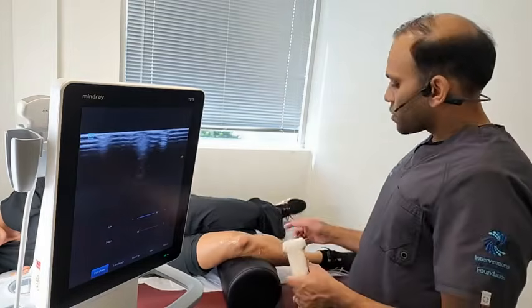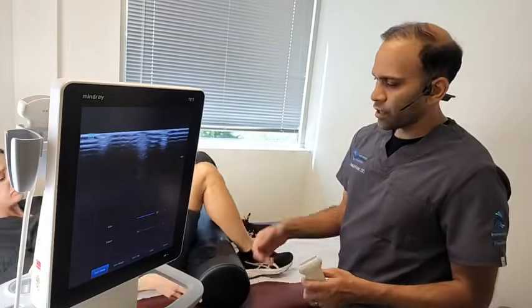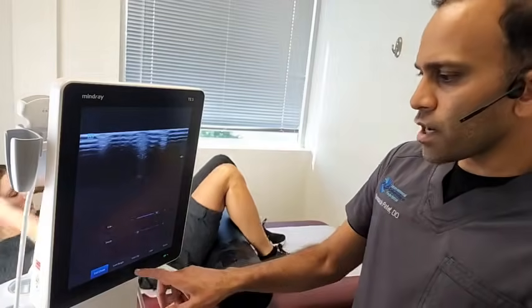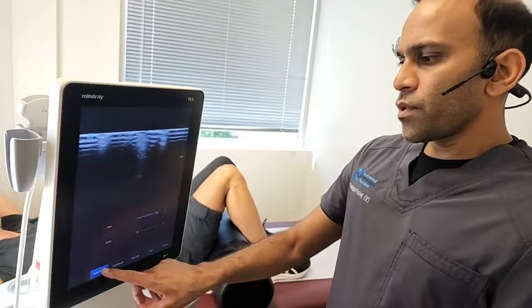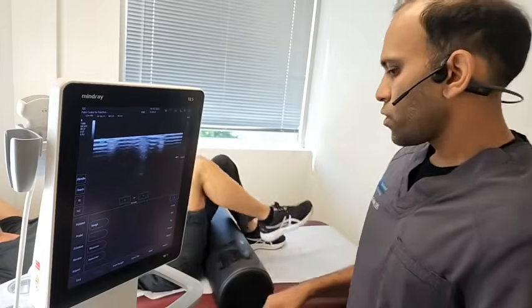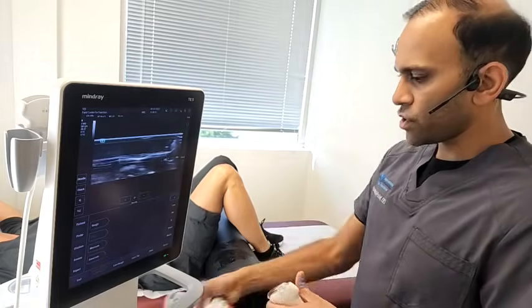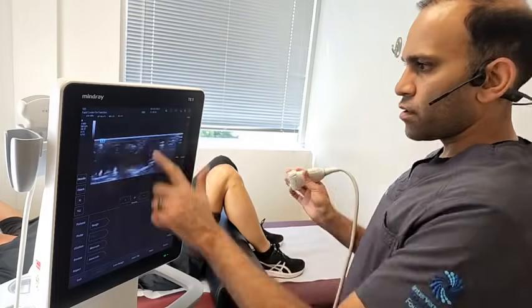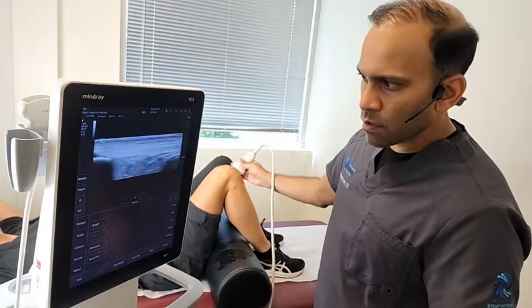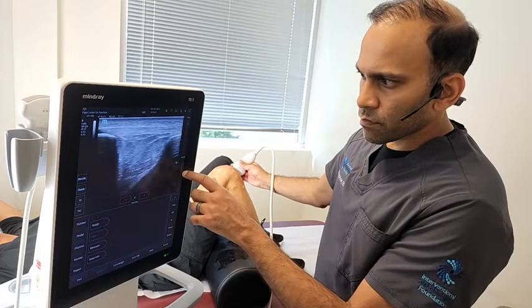So get back on your back and bend your knee as much as you can. Keep this one. So if we look at the front of the knee, you might be able to take a look with this guy here. Now we'll change our probe. There we go.